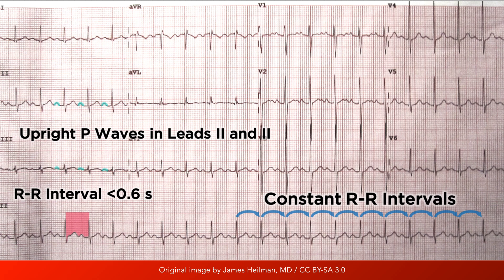To quickly recap: with sinus tachycardia, an upright P wave of constant morphology precedes every QRS complex, with a regular heart rate faster than 100 beats per minute.